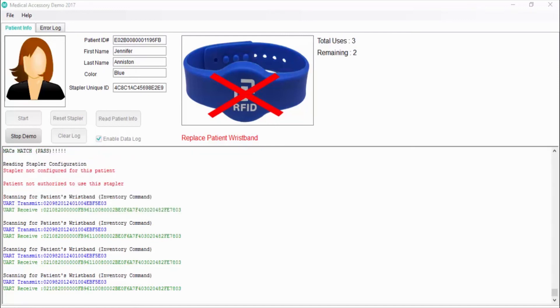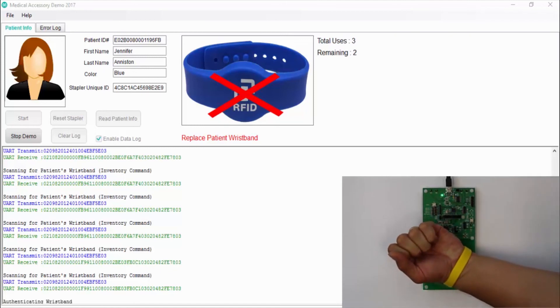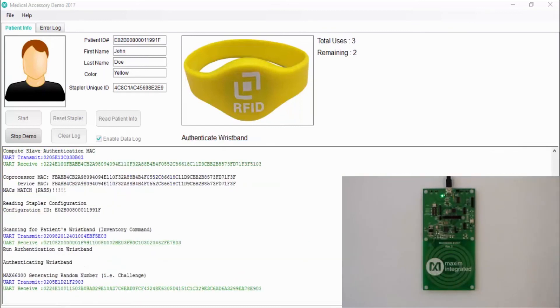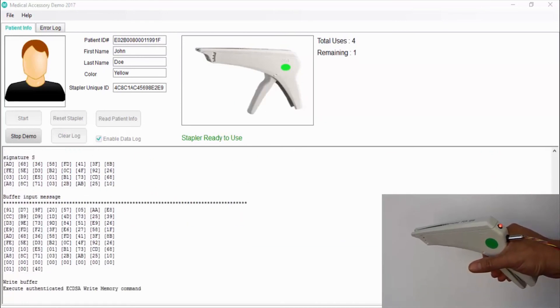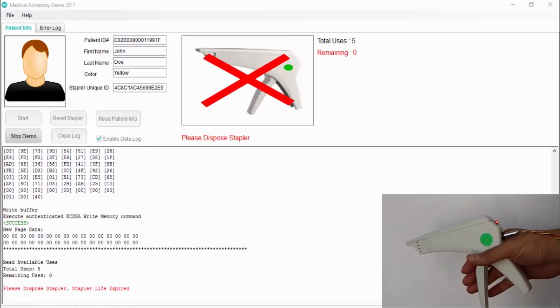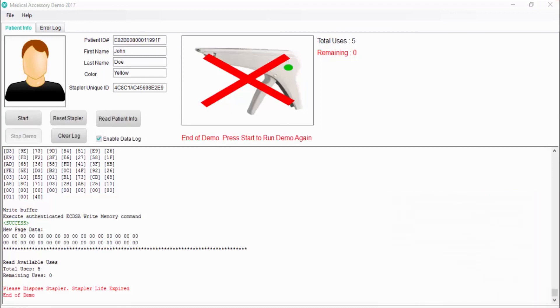Let's go back to the first patient that is authorized with this stapler and finish the procedure. The patient has already used three staples from the five programmed by the manufacturer, leaving only two more uses. I place the yellow wristband on the reader and the patient's info is compared with the stapler. Now the stapler is ready to use and finish the treatment. The GPIO function is being used to control the LED state and provide visual feedback from the memory writes, authentication, and in this case the end of product usage.